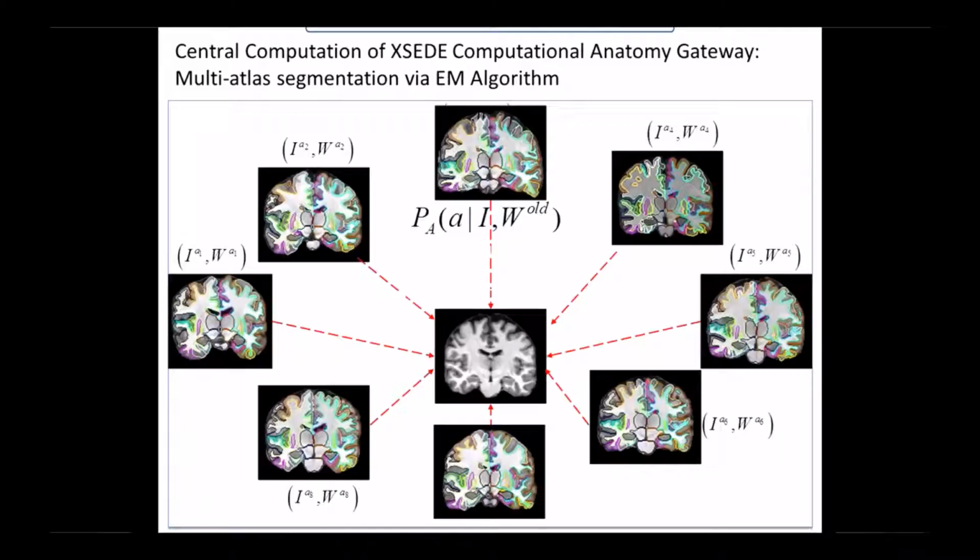A term for this is multi-atlas segmentation, or multi-atlas parcellation. This is exactly like parsing in speech recognizers, only here you're parsing into this ontology of images rather than word streams. We're coming online with 200 atlases. Currently, we make available around 10 to 20 atlases.